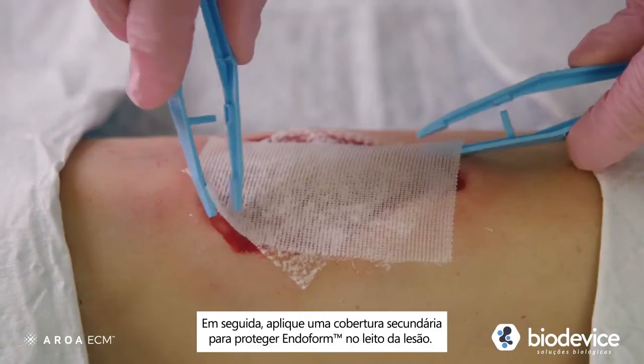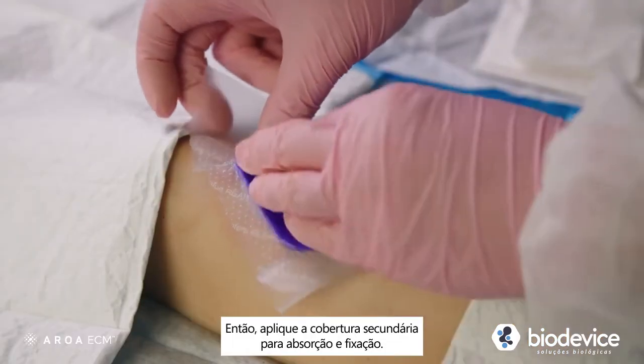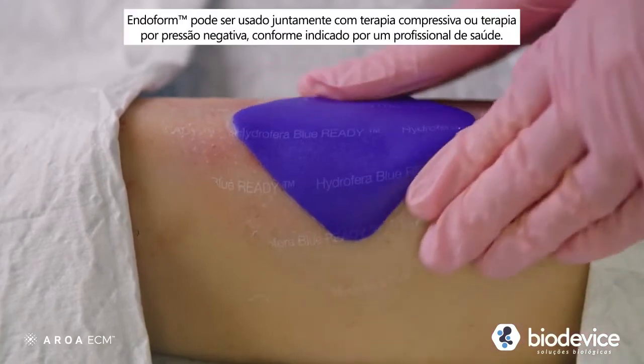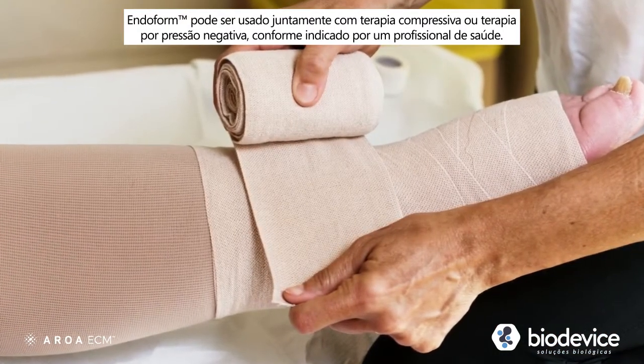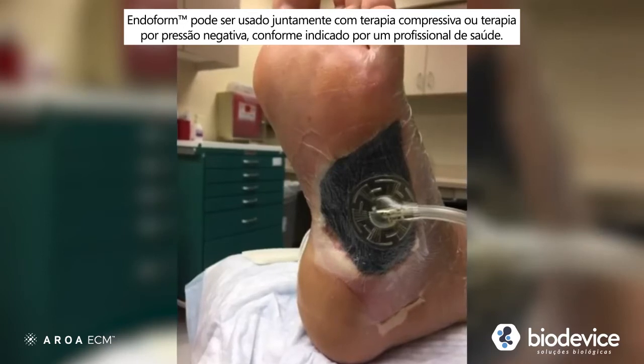Next, apply a secondary dressing to protect the wound bed and the Endoform matrix. Then, secure the cover dressing. Endoform may be used in conjunction with compression therapy or negative pressure wound therapy, as directed by your wound care provider.